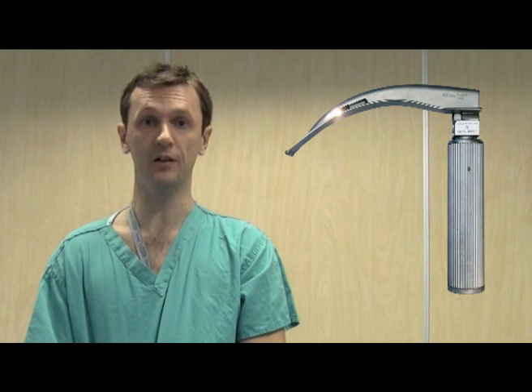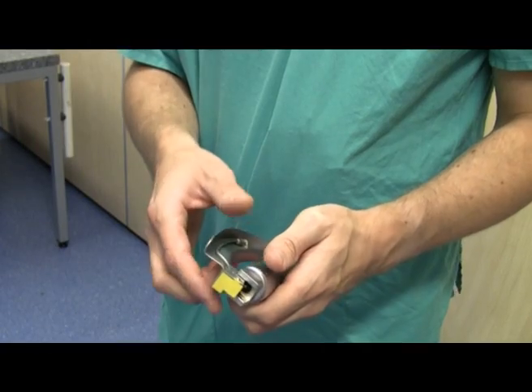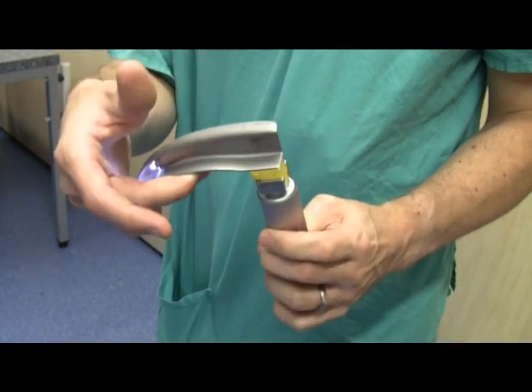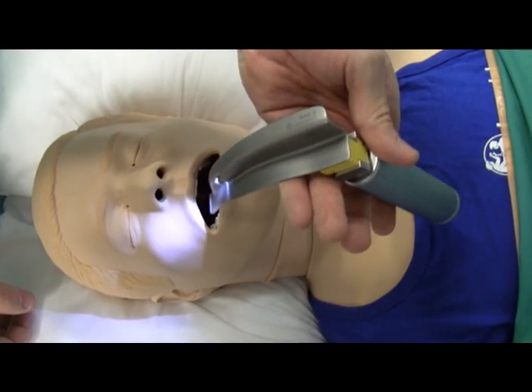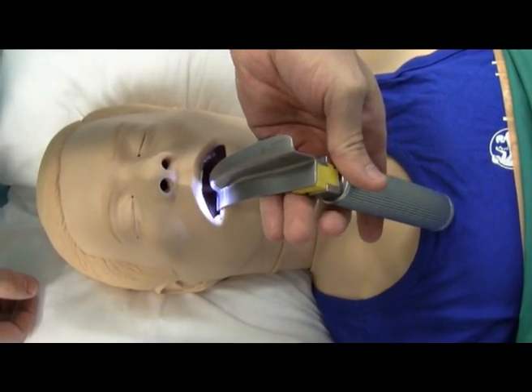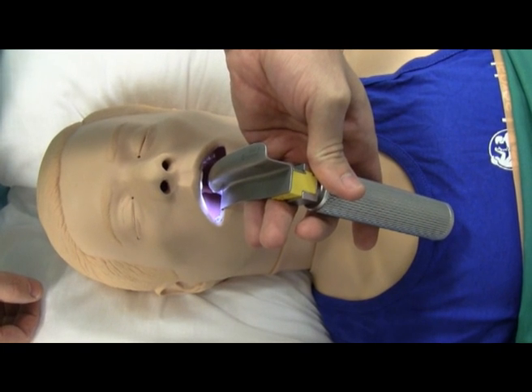Now I'll show you the intubation again but in bite sized chunks. The first thing to say is that the Macintosh laryngoscope is designed to be held in your left hand — try to use your right hand and you'll really really struggle. The laryngoscope consists of a handle, a blade and a light source. The first thing you need to do is to advance the tip of the laryngoscope blade into the right side of the patient's mouth.